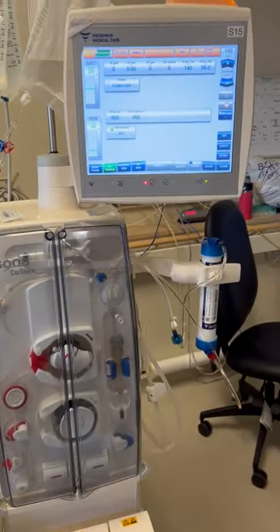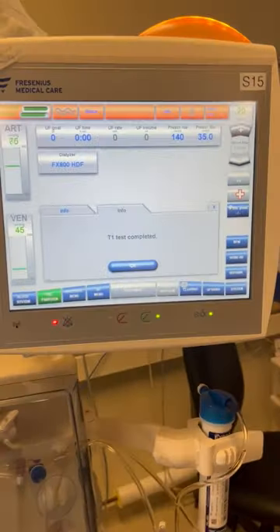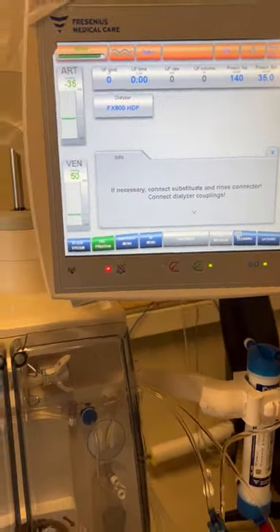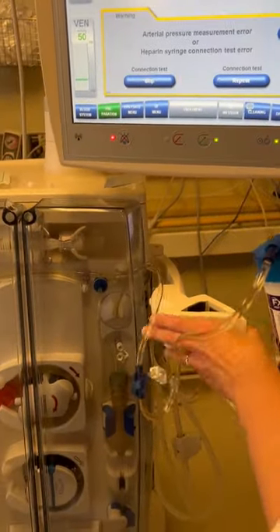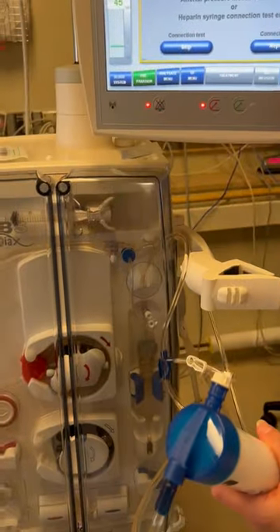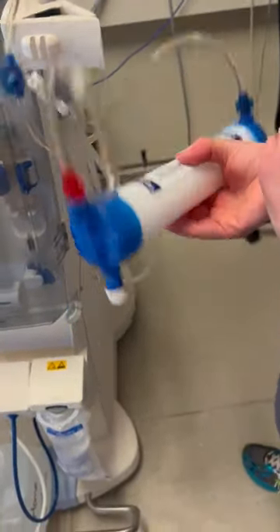We're just waiting for the priming of the syringe and blood lines to finish. Our T1 test is now complete. Now that it is complete, it's telling us to connect our dialyzer couplings. Before we connect our couplings, we're going to want to flip and rotate the dialyzer to put any air out.